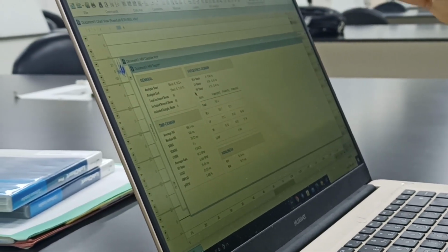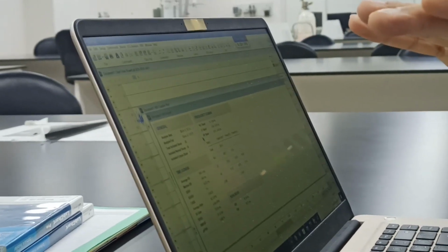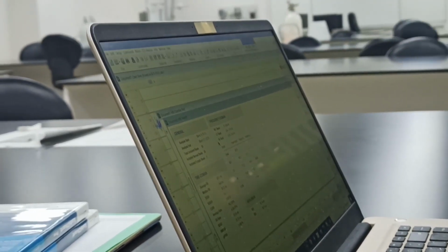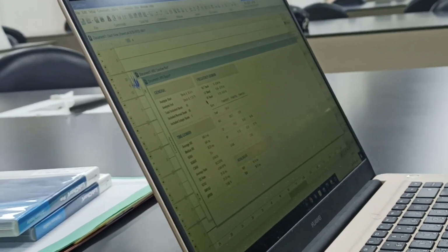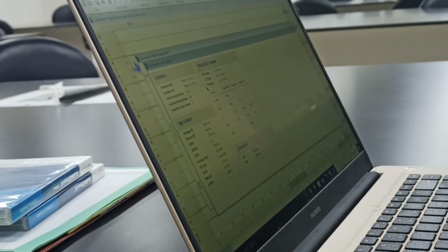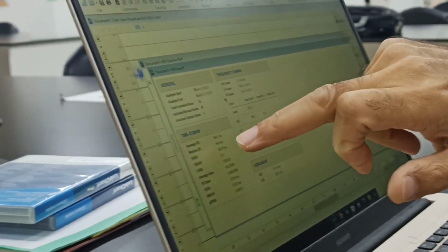So it is heart rate dependent. There are certain normal limits. Too much is also bad. So there will be a range, and beyond that or below that, you have to see. So this is the standard deviation of RR intervals.